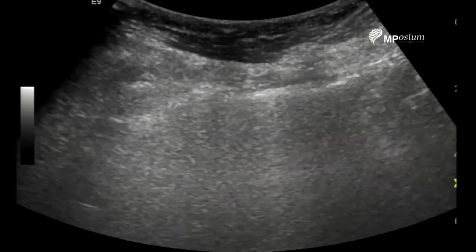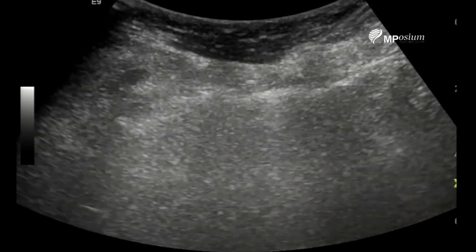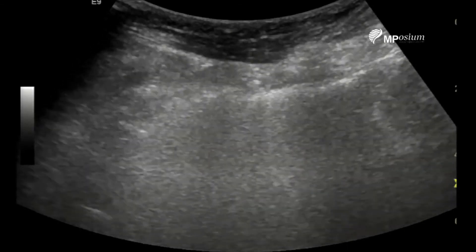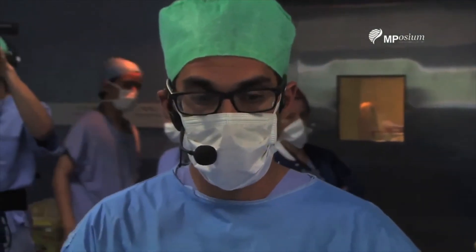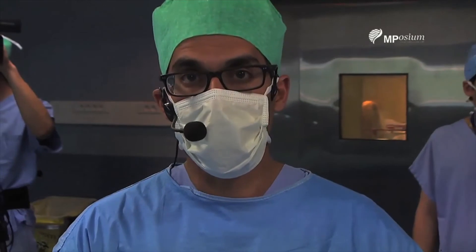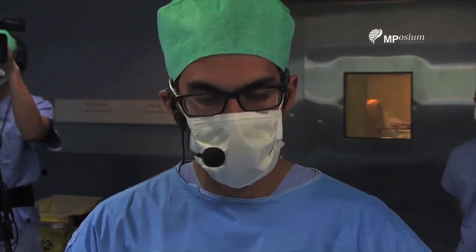The hyperechoic ablation zone is extending almost into the muscle, so I'm being very careful. I hope the patient won't be in too much pain — I'll check her pain level in one hour, but I'm expecting it won't be significant.